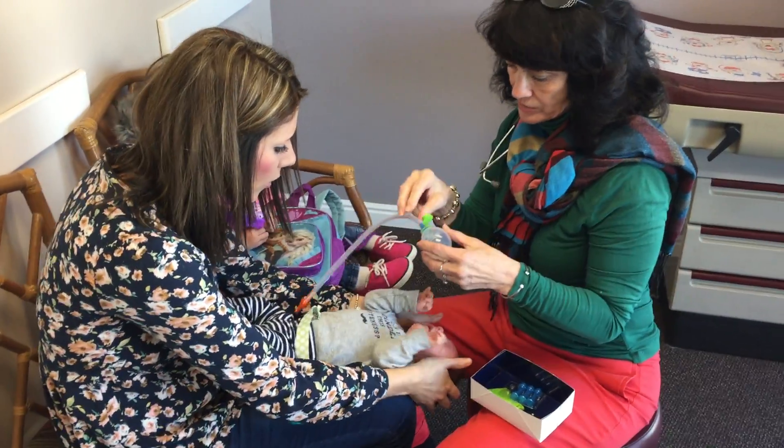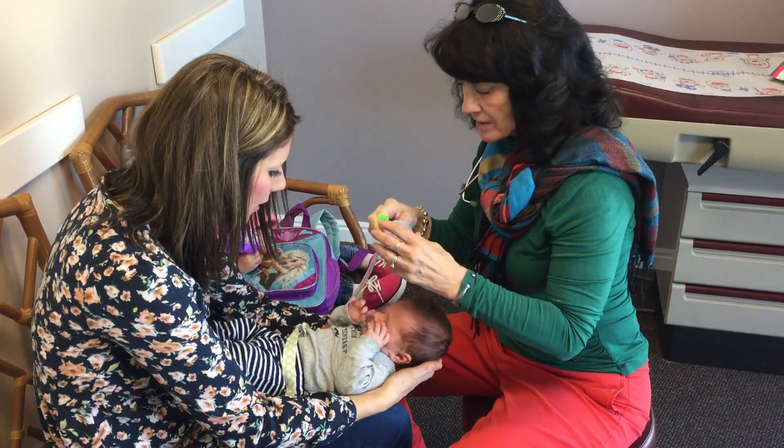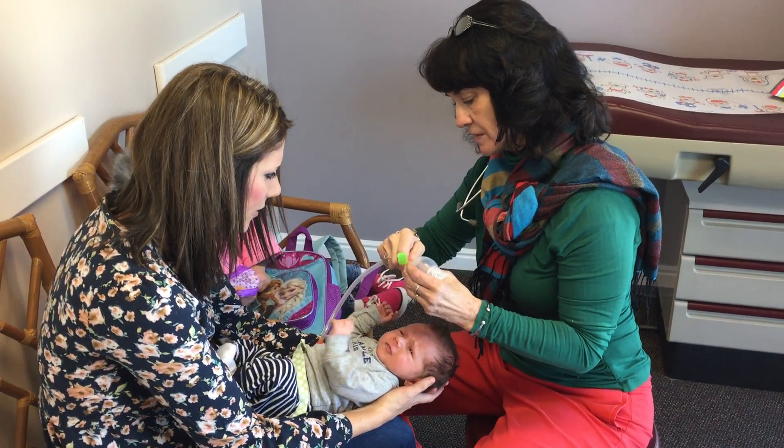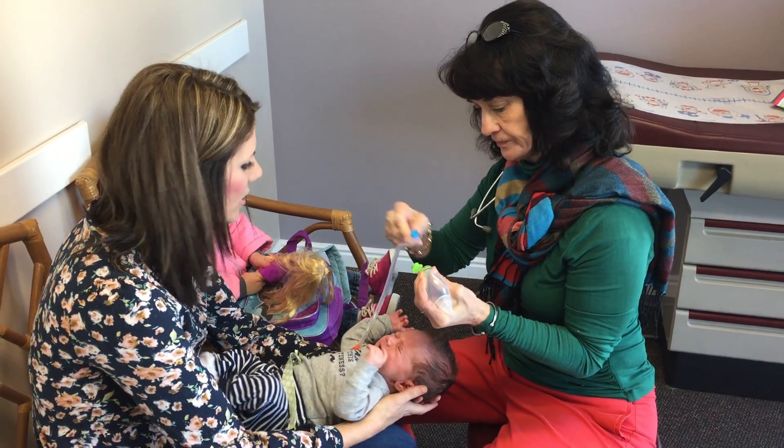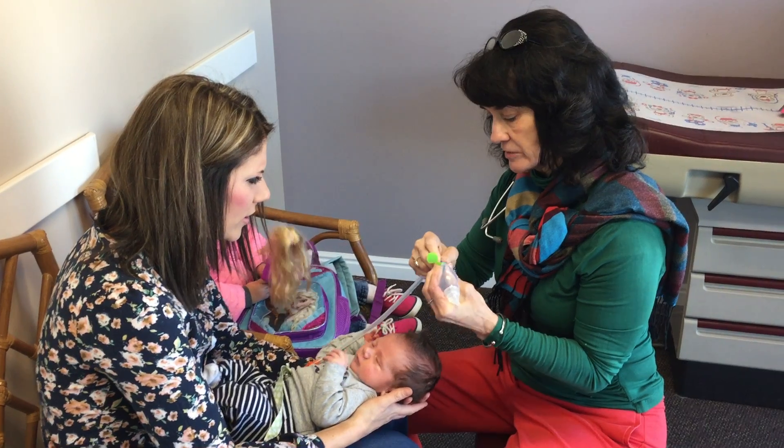And then to take it apart, you just squeeze here and then pull that out to change the filter. That's how you change the filter. And then just reattach.